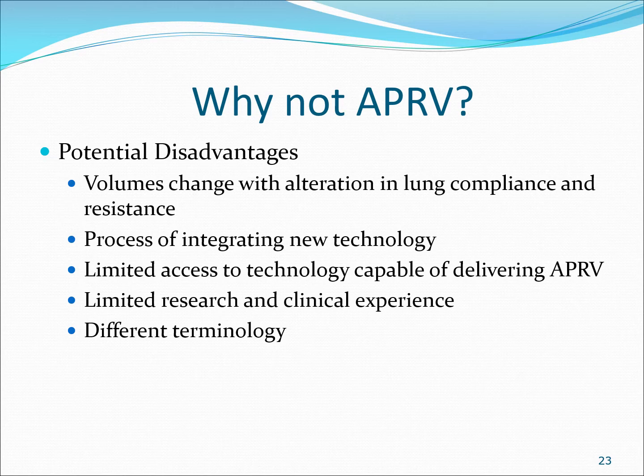Also, people just don't understand how to use it. They hate new technology. A lot of the residents, a lot of the fellows don't know APRV. When I worked there, I did so much education for everybody to learn APRV, and as much education as I did, when we were a university medical center, we used to have new residents come in, and they didn't know APRV, so it was a constant thing. The point is this: people don't know how to use the technology, so they don't like it. They say, this is BS, but it's not BS. You've got to learn it.